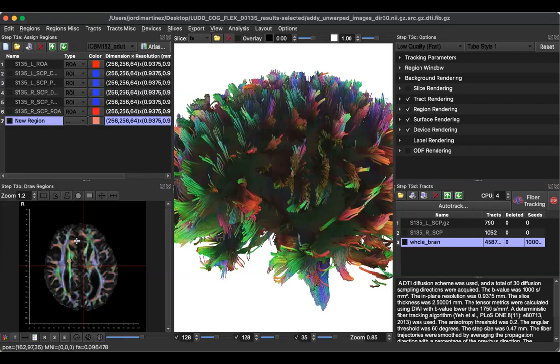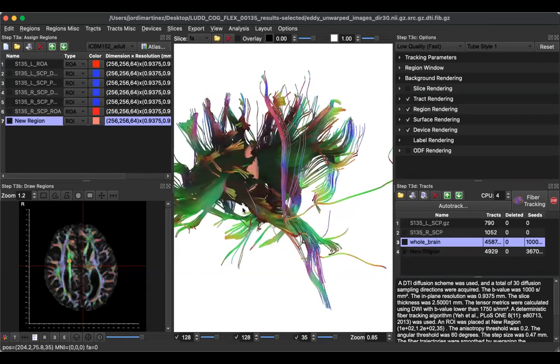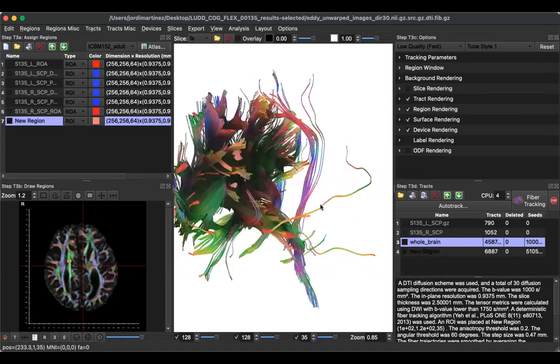Yeah, I was tracking, I think, on the other side, and I couldn't see it. Hard to see it on the other side. Let's see. It looks asymmetrical, right? This is not the exact ROI I would use, but I'm just going to see what happens. It's interesting that the hemispheres look very different, don't they? They look kind of messed up.